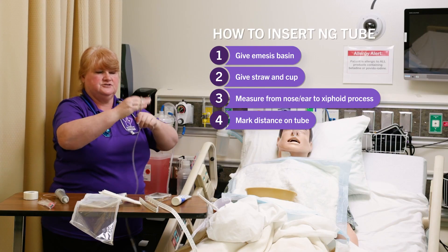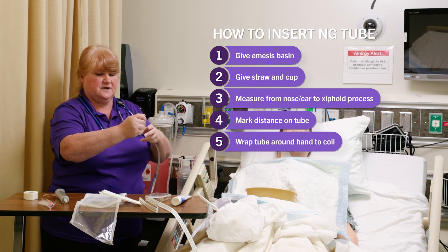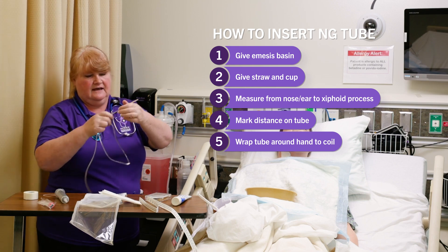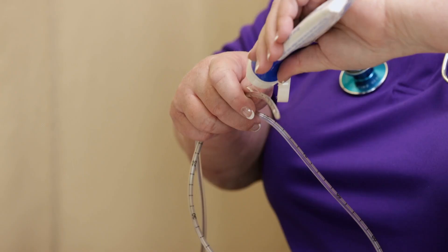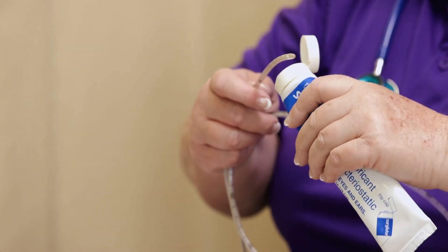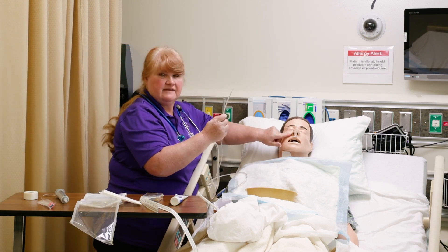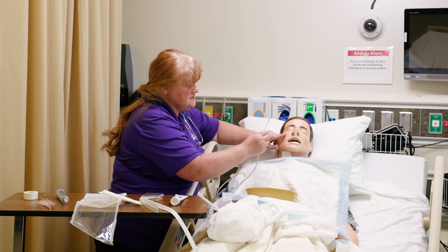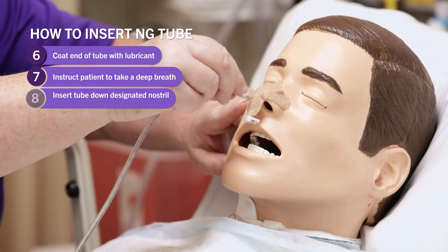Wrap it around your hand so that it is coiled enough that it will go down easier. Then you're going to put your KY jelly on the end of it. Now you're going to instruct your patient — he said that the right nare was the best. So instruct your patient to take a big deep breath, and you're going to advance it down.